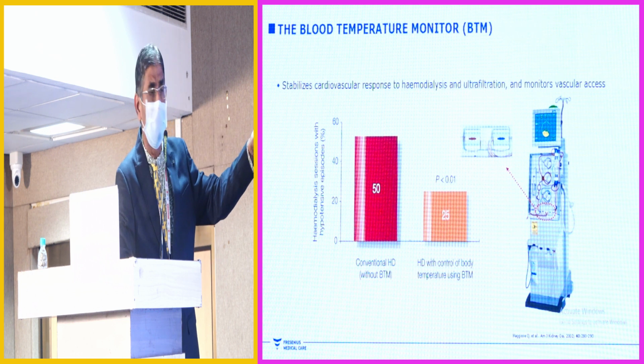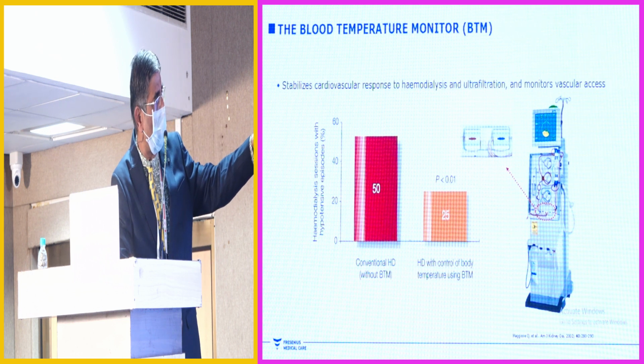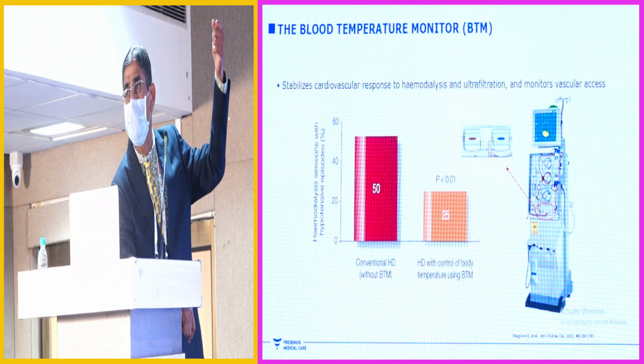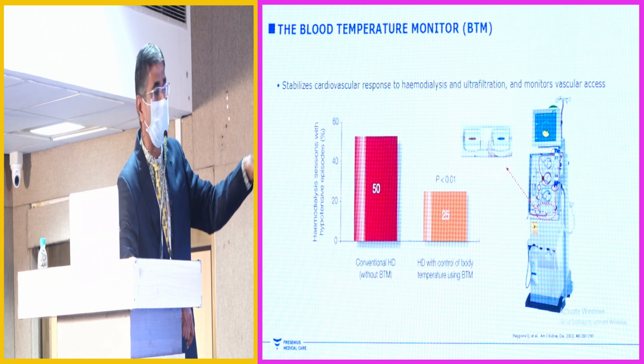You just have to guide the blood lines through your flap. I'm not able to point it. That red one, you just have to open the flap and guide through, and the venous one.